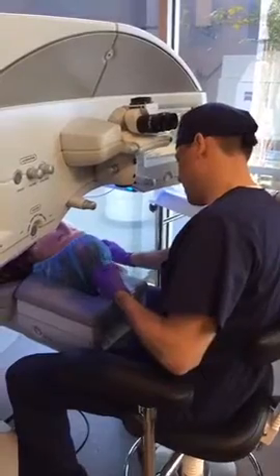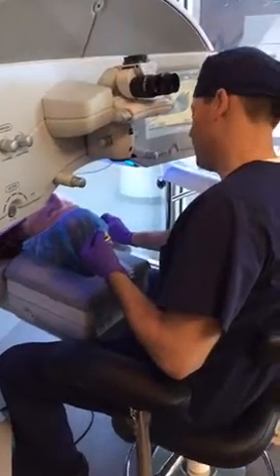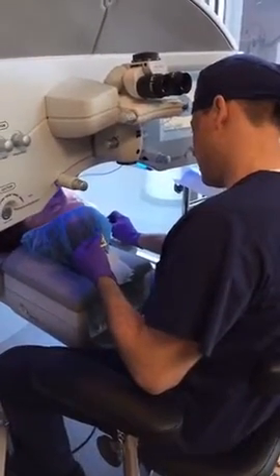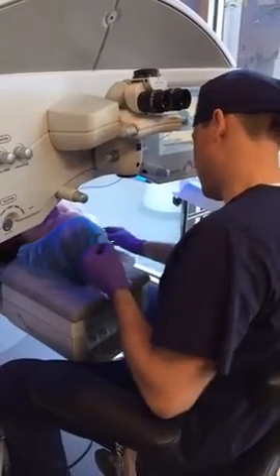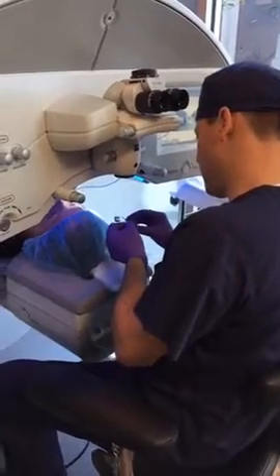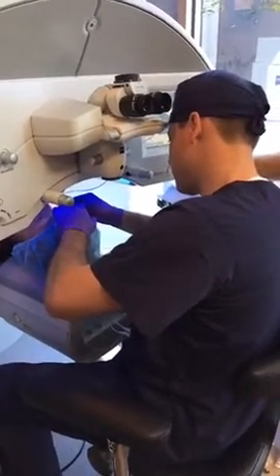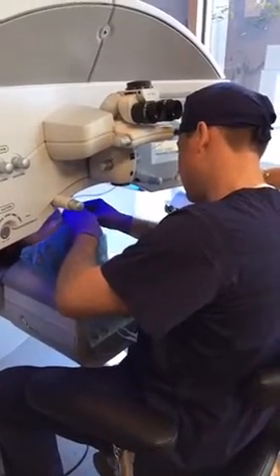Okay, so if you look straight ahead up there, you're going to see that bright white ring I was telling you about. You bring your chin up a little bit, please. Good. And then rotate your head a little bit to the left. Perfect. I'll bring the white ring over to you again. Also, in the middle of that ring, you'll see the green blinking light. This is your eyelid holder, so it's a little bit strange. But what you want to do is just focus your attention on that green flashing light up there.